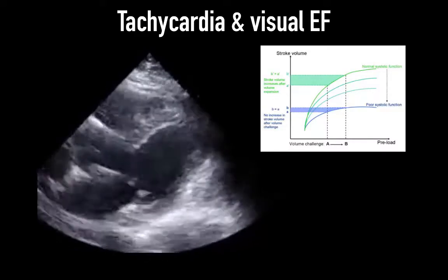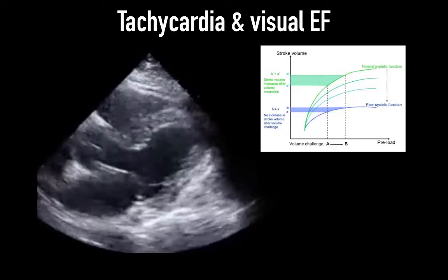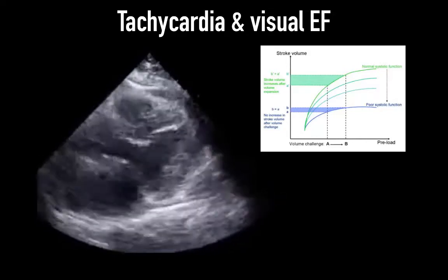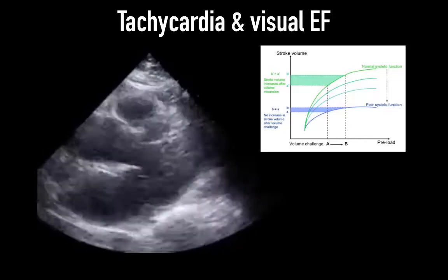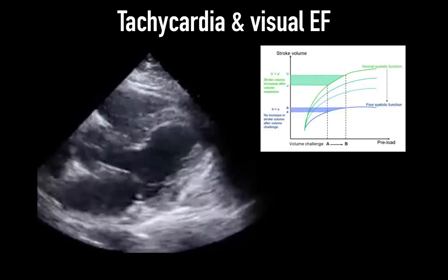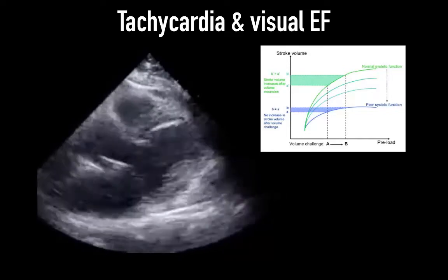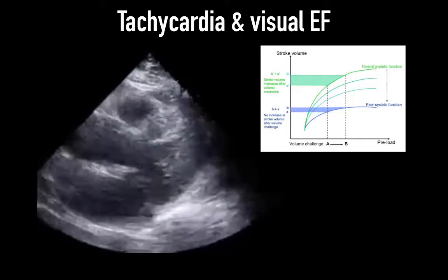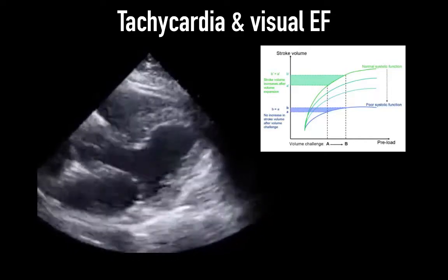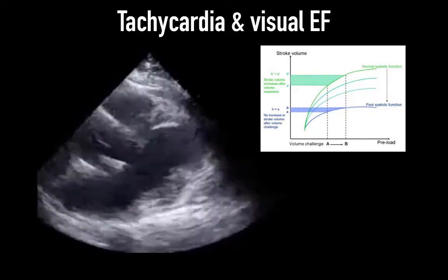In a similar way, tachycardia can lead to significant changes in the LV ejection fraction, usually by an apparent decrease. This is because with a high heart rate comes low ventricular filling and short ejection time, reflected as very fast thickening, contracting, and dethickening, decontracting or relaxing. Often reducing the rate can lead to the normalization of the EF, as in this clip of a patient with AVRT that converts back to sinus rhythm. LVEF assessment in tachycardia often becomes unreliable above 120 beats per minute. Bradycardia is usually less problematic and often shows up as a supernormal ejection fraction.